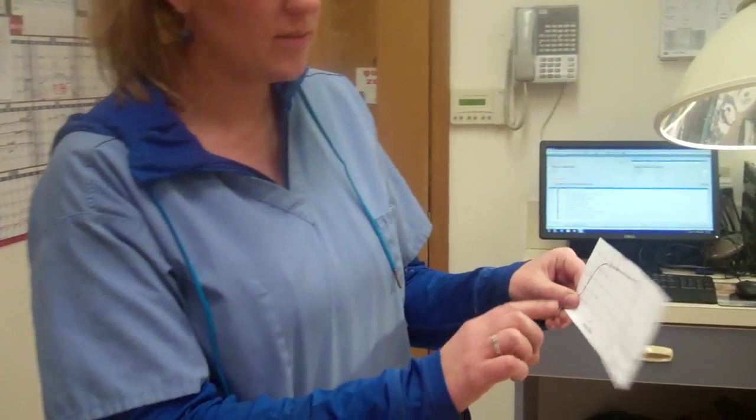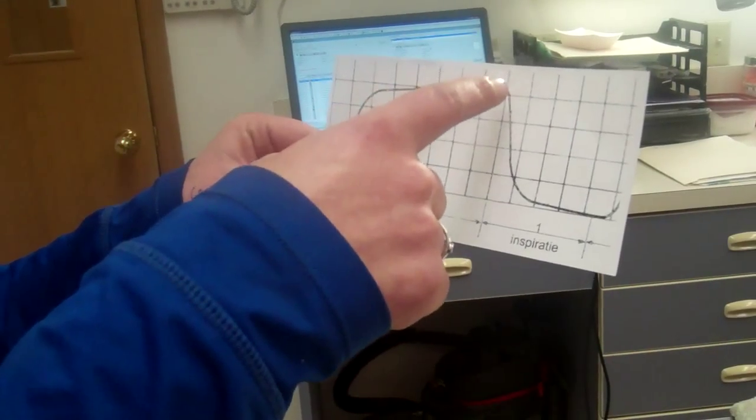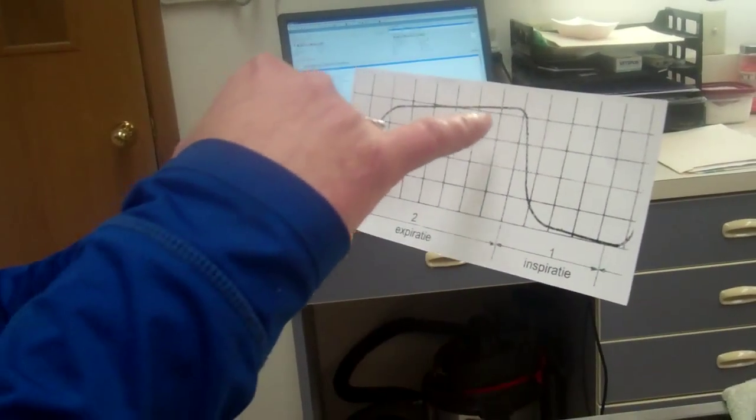And then that outputs, or measures, the exhaled carbon dioxide. So you can see here, this is the end-tidal carbon dioxide, and then this is an inspiration.